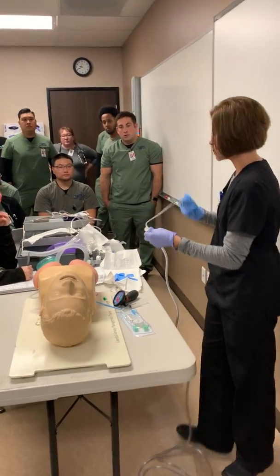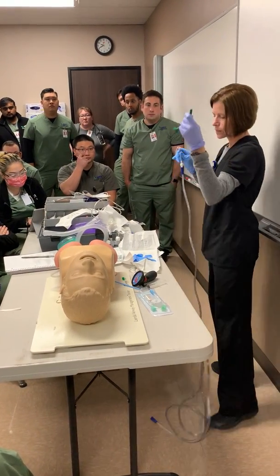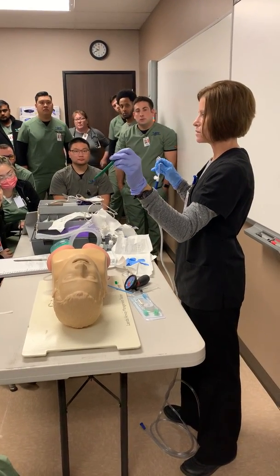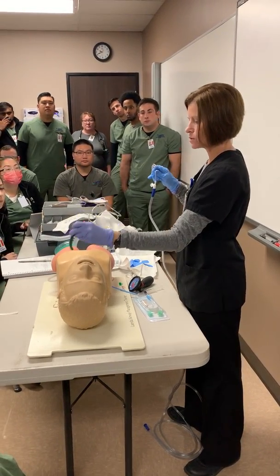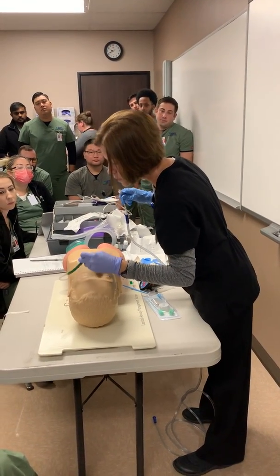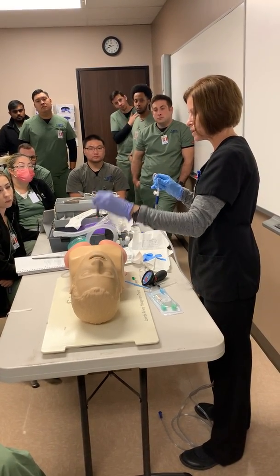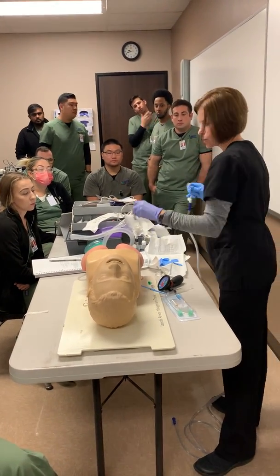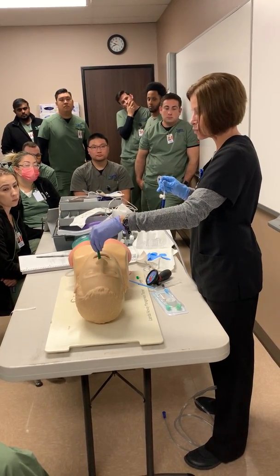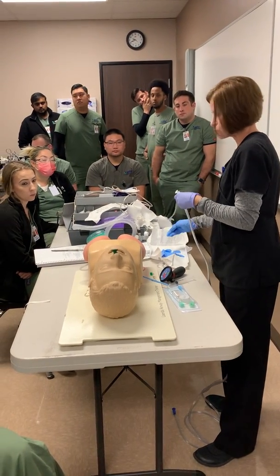Yeah. Remember, we have this other piece of equipment, a nasal trumpet. How do we size this? From nose to the ear. Right. So we're gonna see this. This would be about the right size. While we're here today, you guys practice putting it in. Remember, this is, once again, you'll kind of lube it up. You'll put it in the patient's nose and you'll say this is going to be a little bit of pressure or a lot. We're going to lube this up.